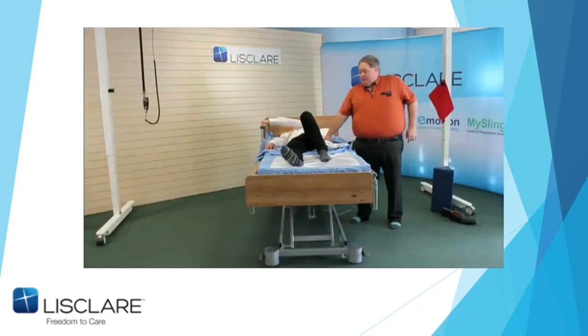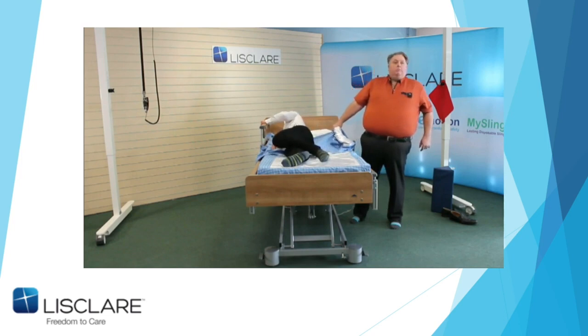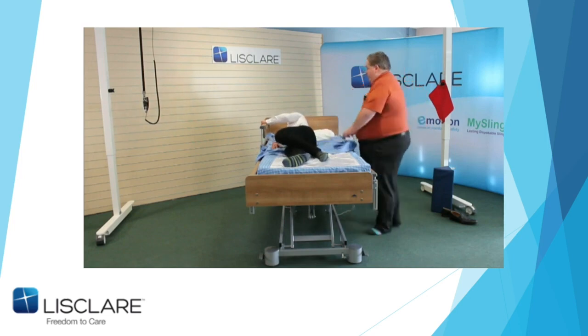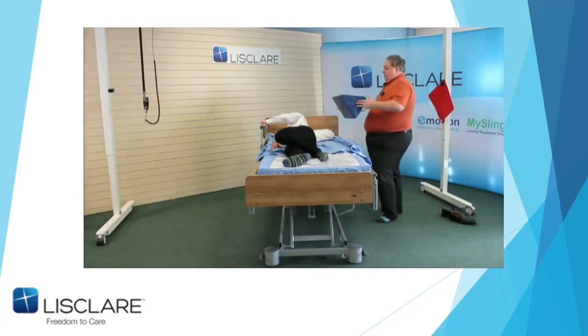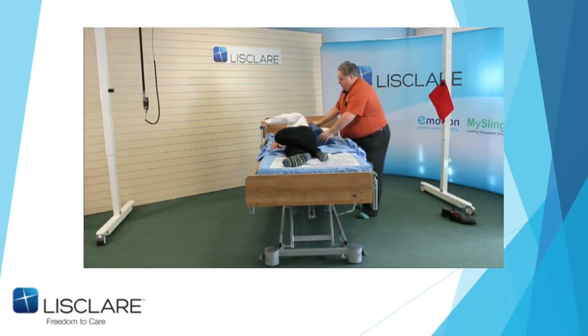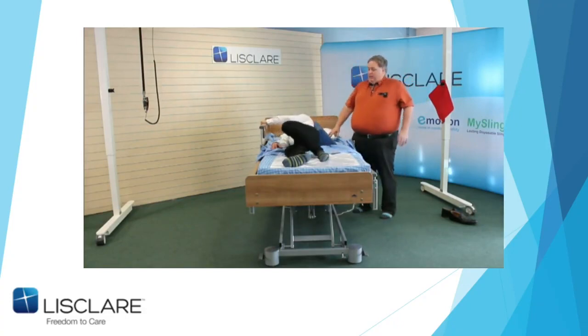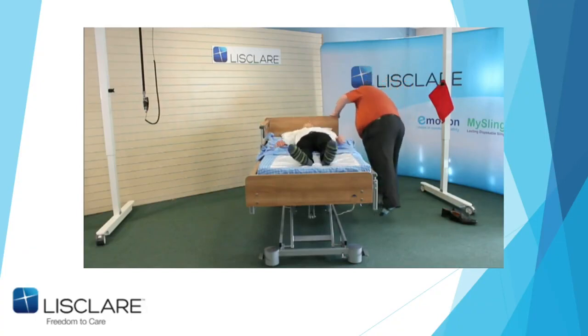If I gently lean back and John pulls, he will turn. Now you know what the wedge is for. The wedge we got made locally in the UK, and there's different acute angles. I like to tend to use the better one. So I can place this in here. If John decides to lean back on me, he can't go anywhere, and this doesn't slide, and I can do personal care.